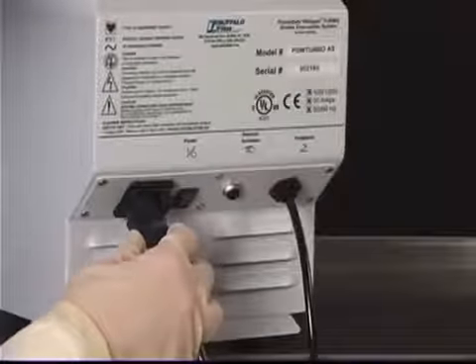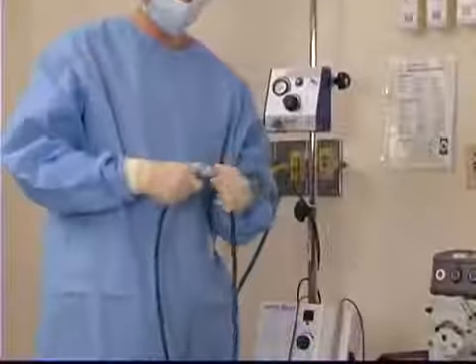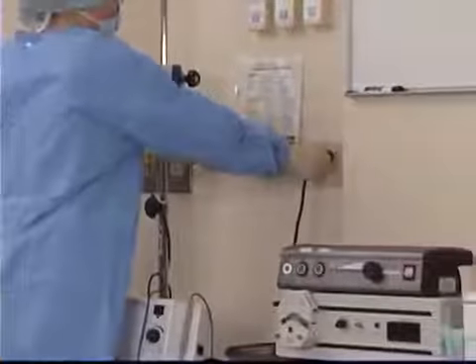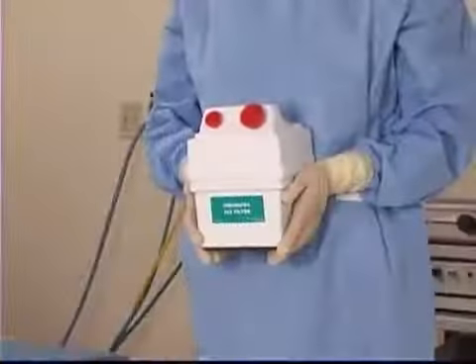Next, plug the non-receptacle side of the modular power cord into the back of the unit. Plug the opposite end of the cord into a grounded wall outlet. Ensure that the power cord is routed on the floor in such a way that it does not create a trip hazard. You are now ready to insert your ViroSafe filter.